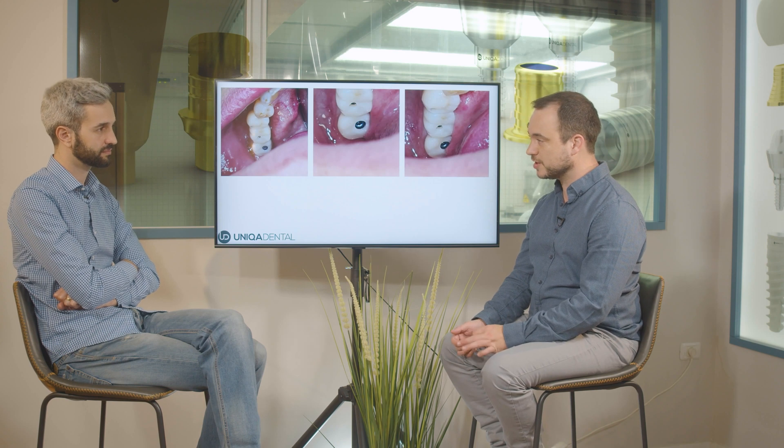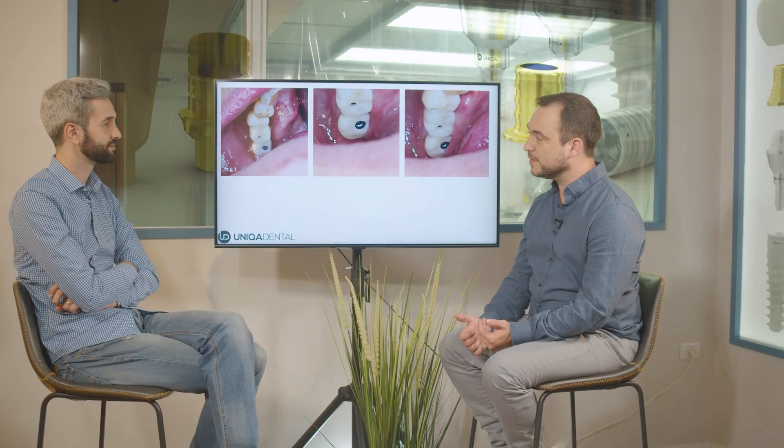The bigger the sleeve you use, the smaller the screw channel will be. When using a standard or large sleeve, there's enough space inside the sleeve to keep the screw — you insert the screw into the sleeve and cement the sleeve with the screw to the crown, leaving only a small channel for the hex driver. With a small sleeve, the screw can't be kept inside it, so it must pass through the crown, requiring a larger channel. In many posterior teeth, there isn't enough height to use a standard sleeve, so you're forced to use a smaller sleeve and a larger screw channel.